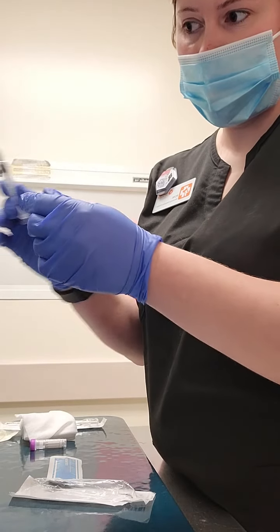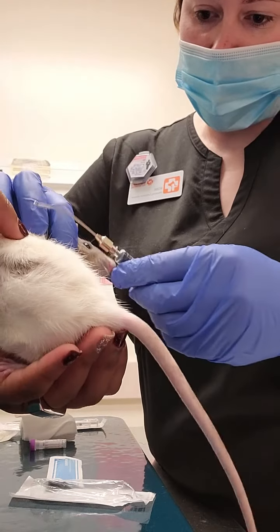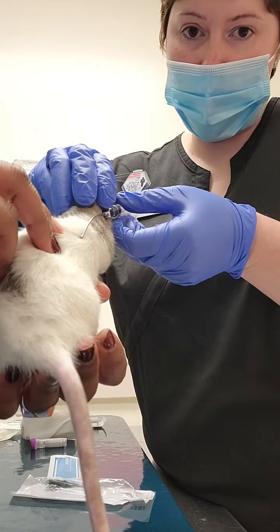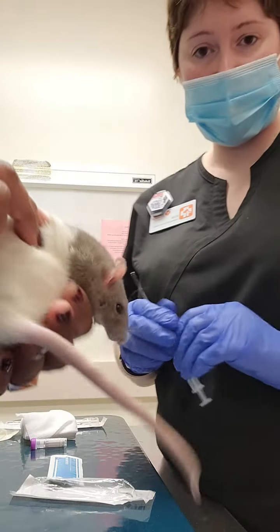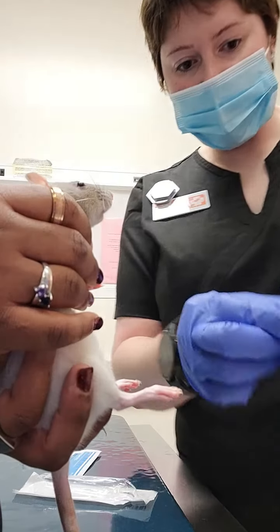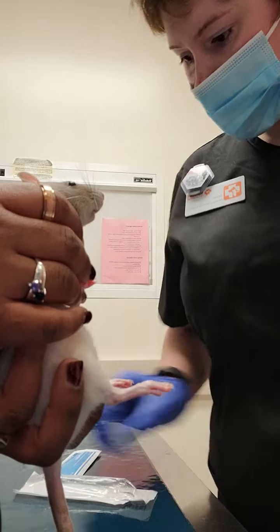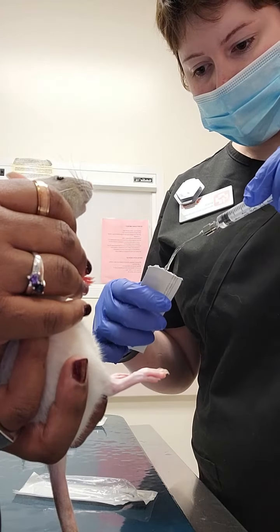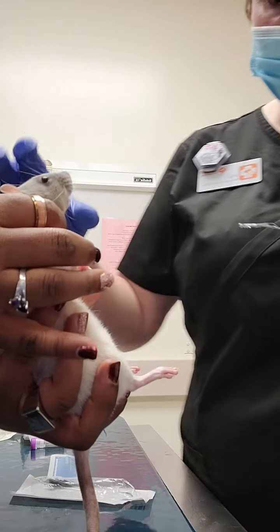How I measured the feeding tube was I measured from the tip of the animal's head to the last rib. I placed the feeding needle with the syringe attached — I've already lubricated the tip — and I'm going to place it into the esophagus of the patient and administer saline through the feeding needle. Then I'm going to carefully withdraw the needle without rotating it and make sure that the rat is okay.